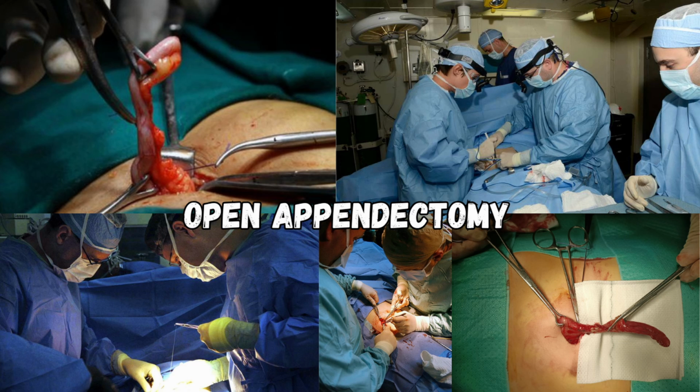Step 3. Dissection through muscle layers. The external oblique aponeurosis is opened in line with the incision, using Metzenbaum or Mayo scissors, and the underlying muscle layers, the internal oblique and the transversus abdominis, are bluntly separated with Kelly clamps or a finger sweep. Take care to avoid injury to the iliohypogastric and ilioinguinal nerves, which may run just medial to the incision.